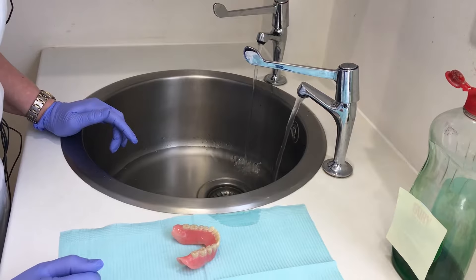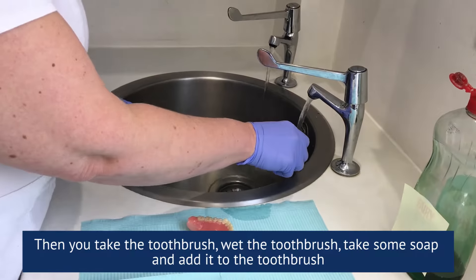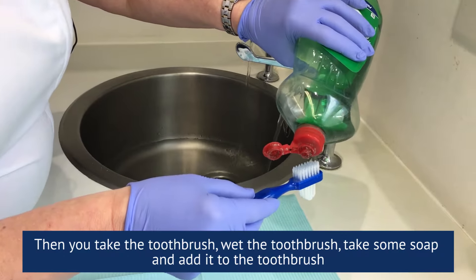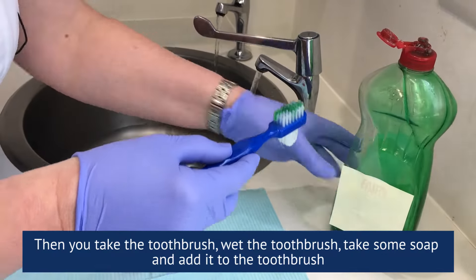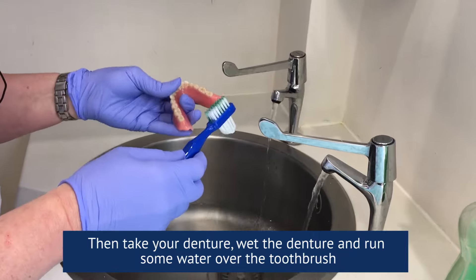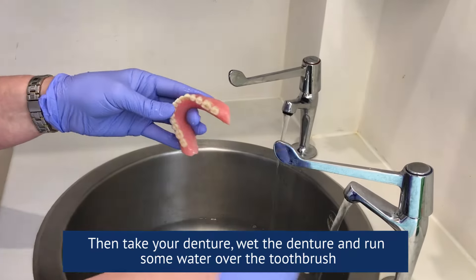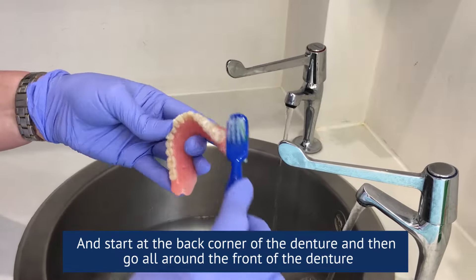Take a toothbrush, wet the toothbrush, take some soap and add it to the toothbrush. Then take your denture, wet the denture, and run some water over the toothbrush and start at the back corner of the denture.